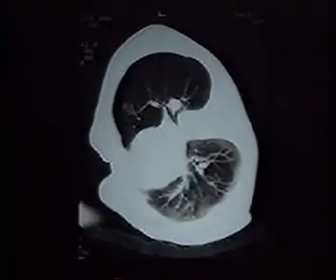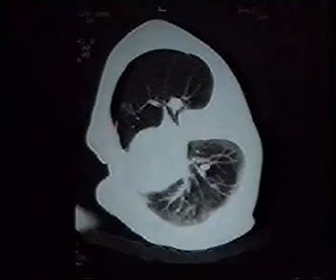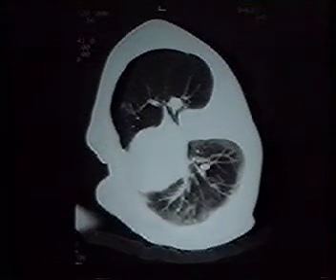Here's an example of a patient who is biopsied using CT guidance for a nodule mass seen here in the left lateral lung. In fact, you can see the tip of the needle actually in this lesion. This lesion turned out to be an adenocarcinoma of the lung. And as is our routine, immediately after the biopsy, we obtain an image through the thorax to make certain that the patient has not developed a pneumothorax. And as you can see here, the patient has a small pneumothorax. The patient was asymptomatic, and we opted to just observe this patient.